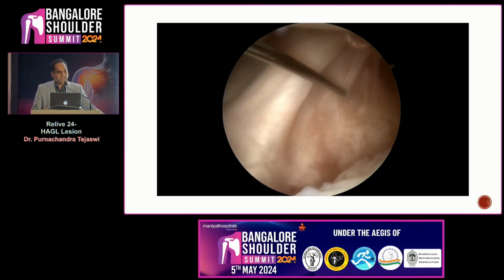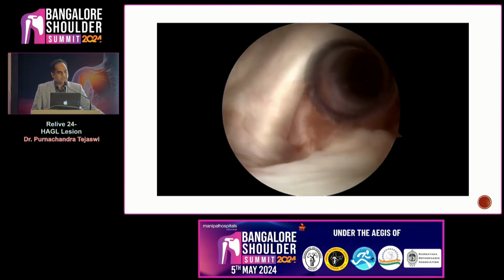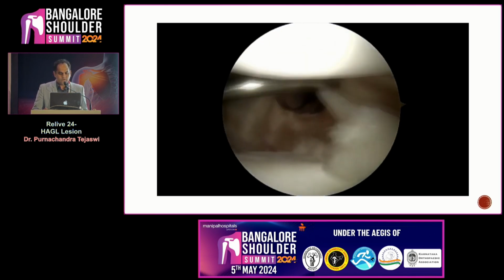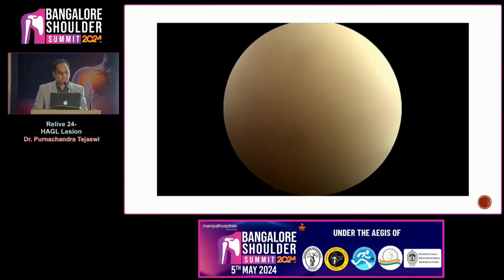Regular antero-inferior and antero-superior portals are created. The antero-superior portal becomes the viewing portal for the entirety of the case. This is usual till now. Once this is done, the scope is shifted from the posterior to the antero-superior portal.